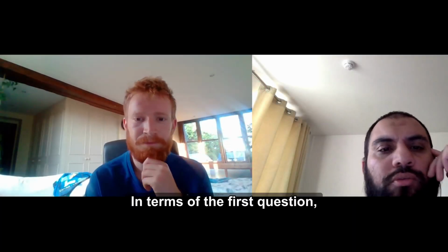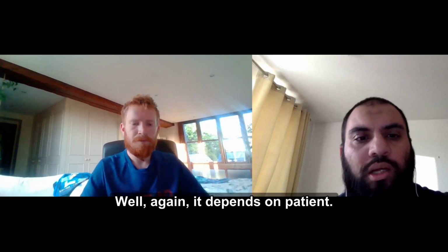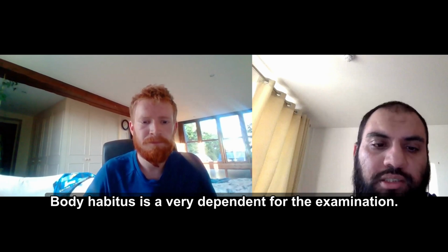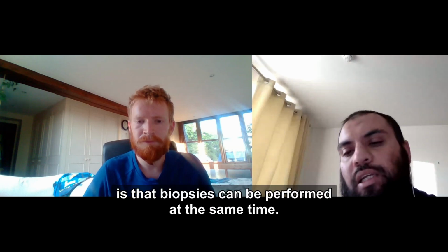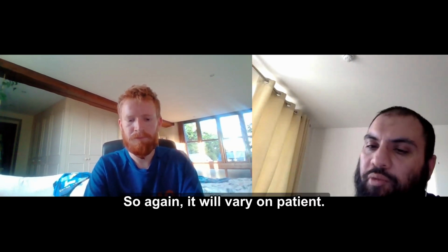In terms of the first question, is that abdominal or transrectal ultrasound? Well, again, it depends on patient body habitus. It's a very operator-dependent examination. If you can get good views on abdominal ultrasound, fine. The benefit of transrectal ultrasound is that biopsies can be performed at the same time. So again, it will vary on patient.